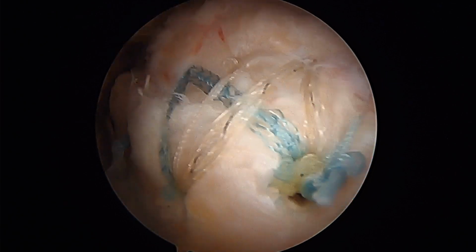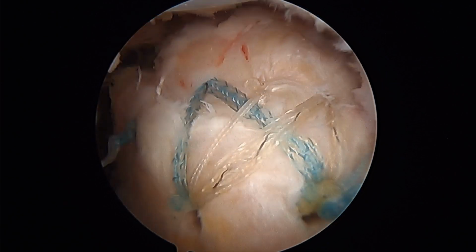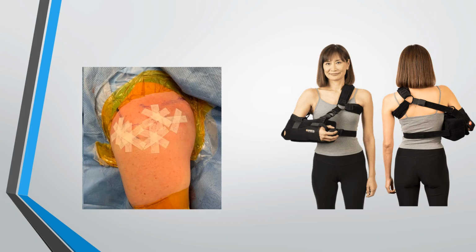After the repair is complete, the arm is taken through gentle range of motion to ensure the repair is secure. The incision sites are then closed and a sterile dressing is placed. The arm will be then fit with a sling that will be required to be worn to protect the rotator cuff tendon following its repair.